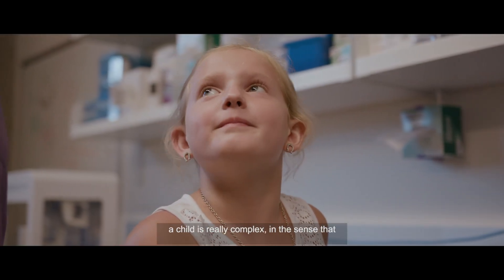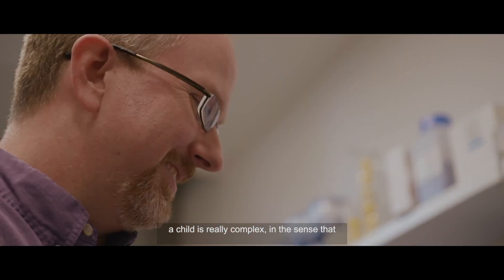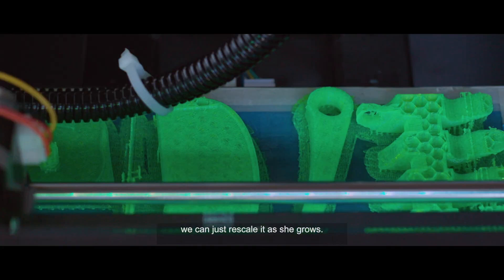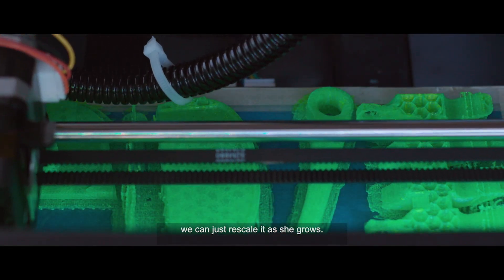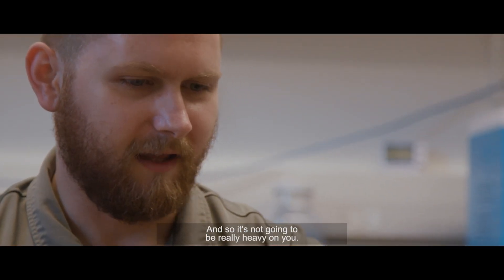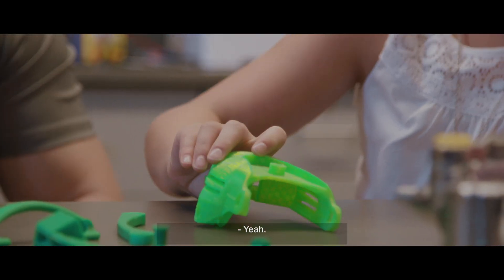Creating a prosthetic for a child is really complex in the sense that they outgrow them so quickly. One of the benefits of 3D printing is that we can just rescale it as she grows. And you could feel how light it is, so it's not gonna be really heavy on you. It does look like what I thought it would look like.